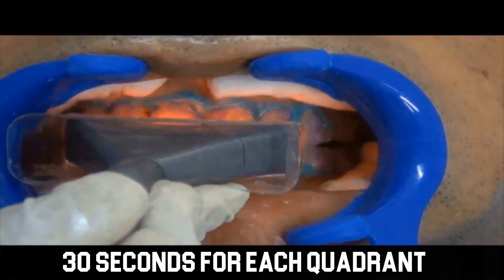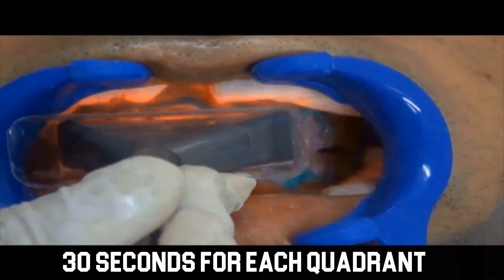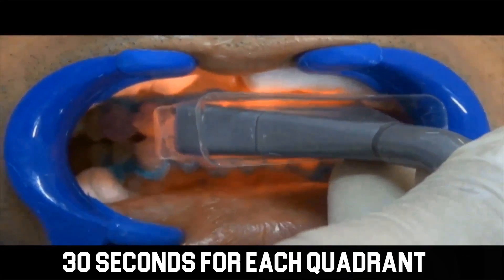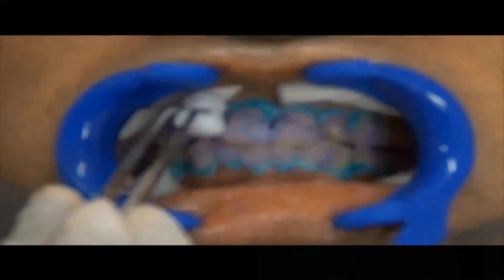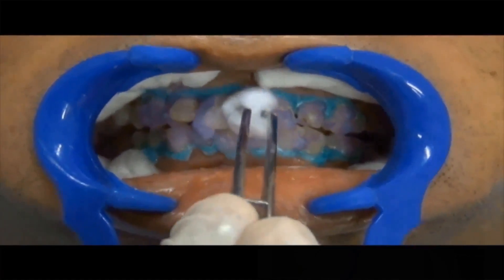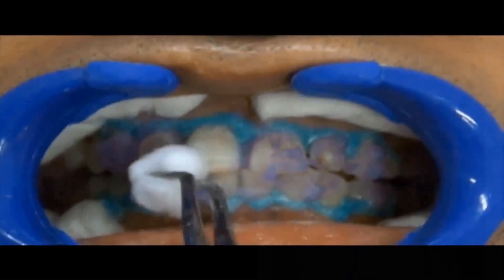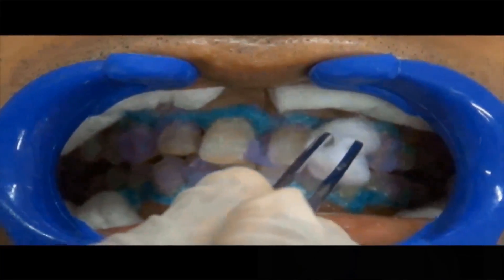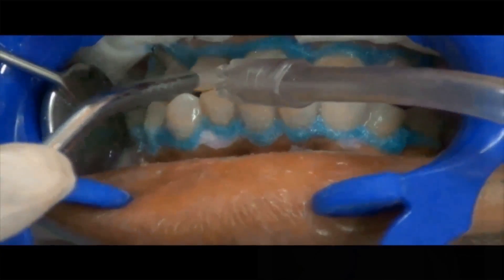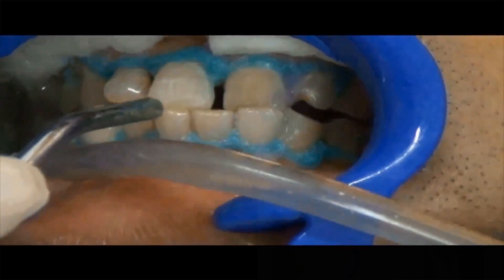Repeat the cycle of 30 seconds 4 times. Remove the bleaching gel using cotton, followed by high speed suction, then flush with air and water spray. Do not dislodge the liquid dam at this step.